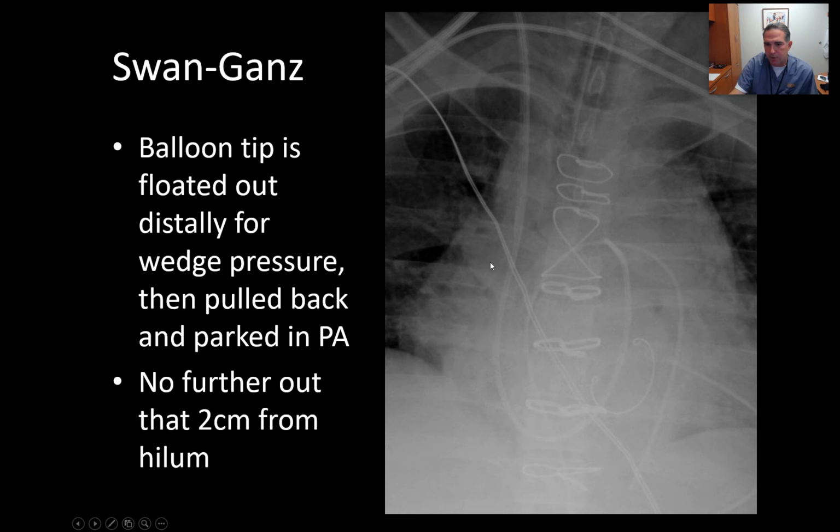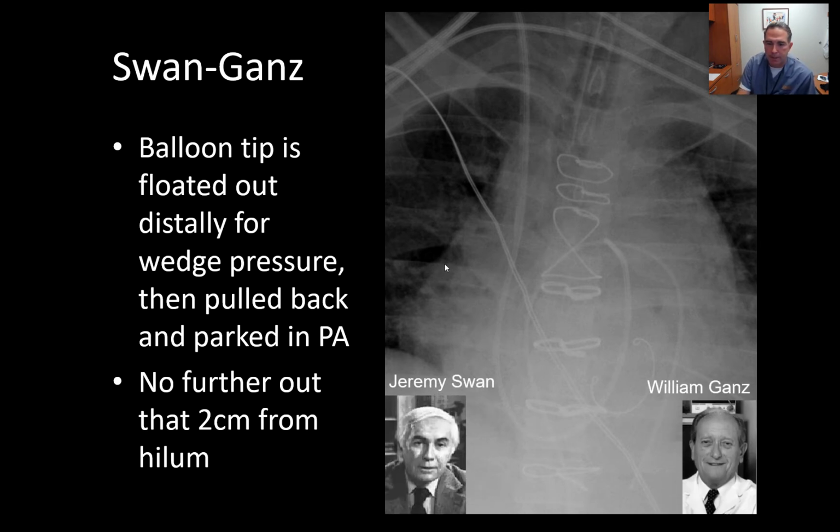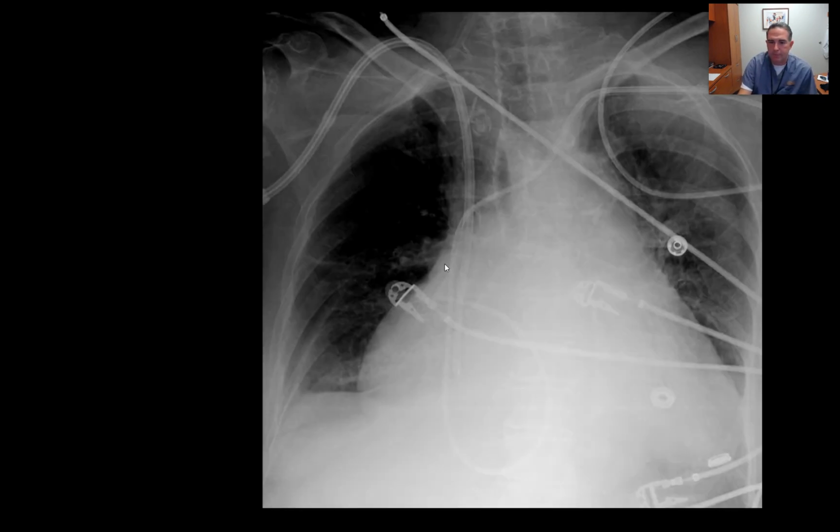I don't know where to start that measurement, but if it was out here, I'd let them know, hey, it overlies the right hilum. Any further out here, you certainly don't want it left out here. And that's, again, 2 docs invented that. Swan-Ganz coiled in the right atrium.